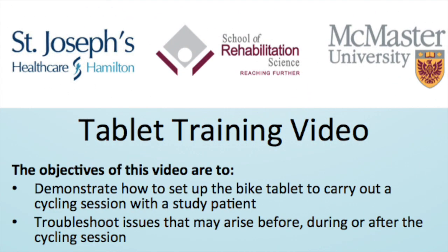The objectives of this video are to demonstrate how to set up the bike tablet to carry out a cycling session with a study patient, and troubleshoot issues that may arise before, during, or after the cycling session.